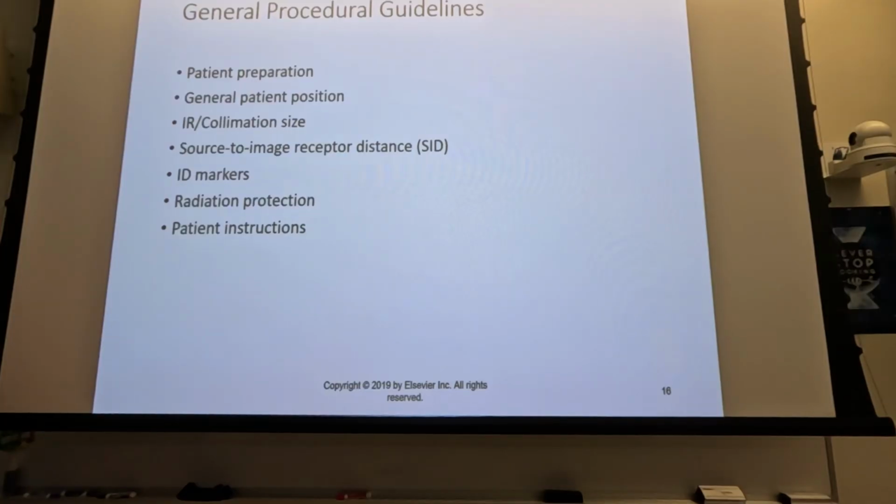There may be legitimate reasons why a patient comes in with a laceration or some sort of trauma to the left hand and you're doing a right hand. There may be legitimate reasons for that. It may be that it was entered incorrectly. So if you shoot a right hand because that's what the order called for, and they just entered it wrong, you're going to have to go get the patient and bring them back and shoot the other one as well. So don't be afraid to ask questions. Some of your ER docs will be very approachable, some not so much, but it's your job not to please the radiologist first, or even the ER doctor, but to take care of the patient. You're the patient advocate first.